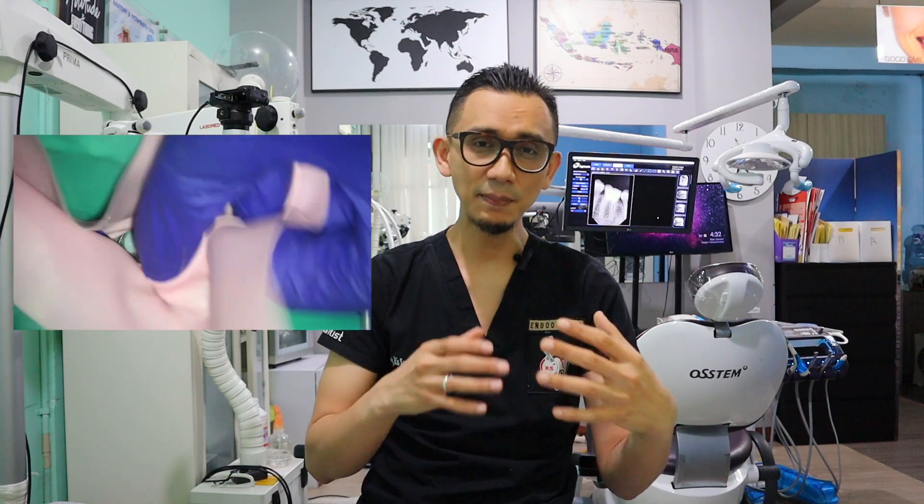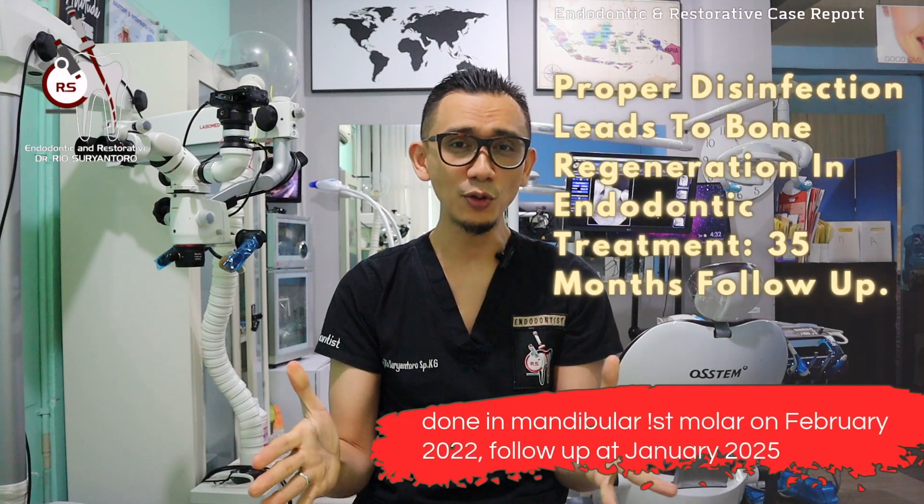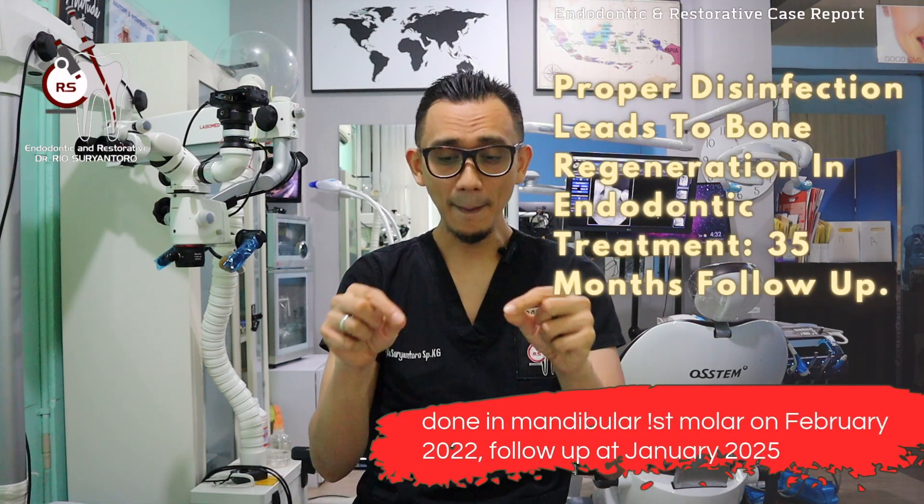Third, in this video I'll also put footage of changing the multiple split dam isolation technique into a single isolation technique, because before preparing the canal and doing proper endo, I need to do rewalling or pre-endodontic restoration. I hope that this video is useful for you, particularly when you are dealing with such cases.